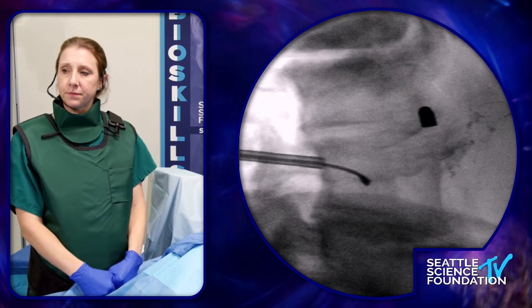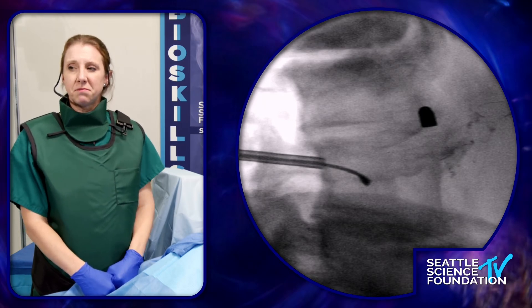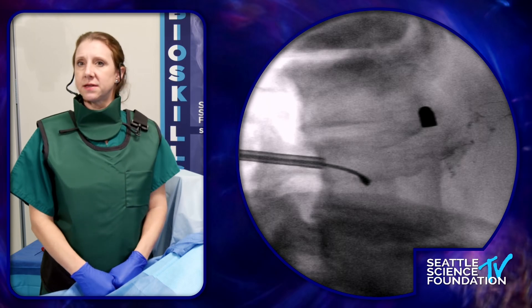So your posterior third — it looks like it's just maybe 30 or 40 percent position.